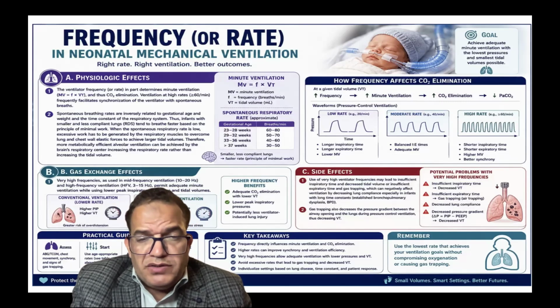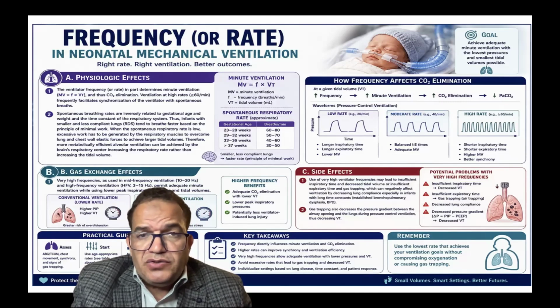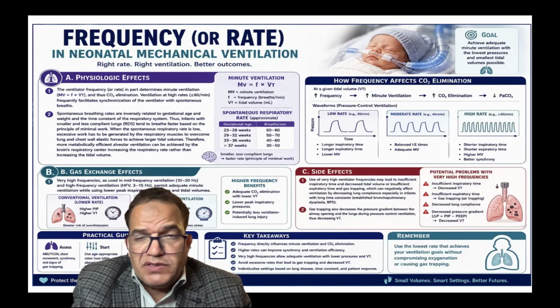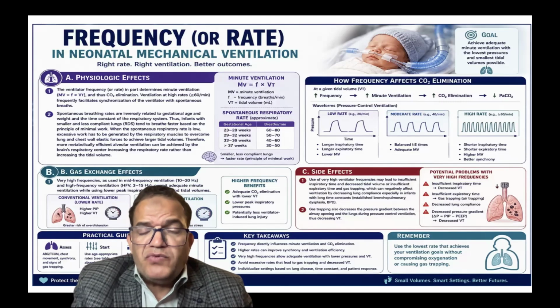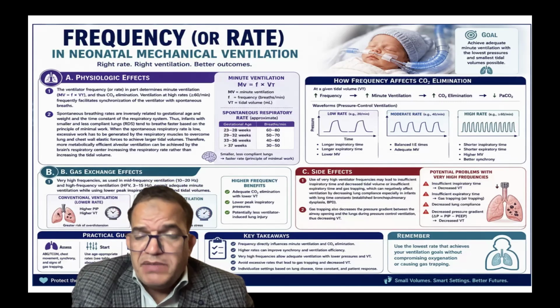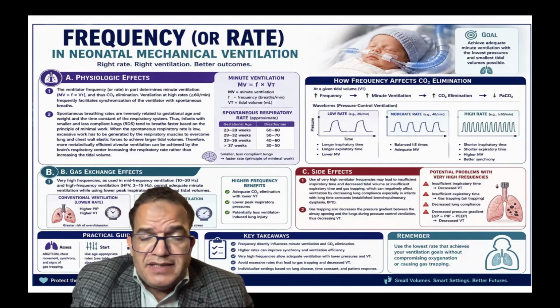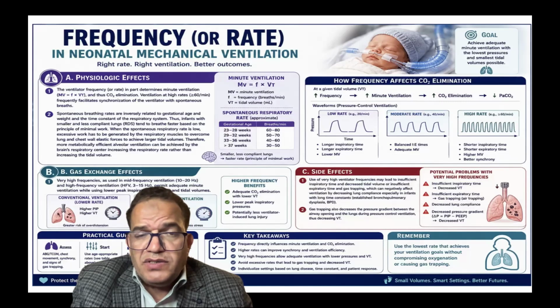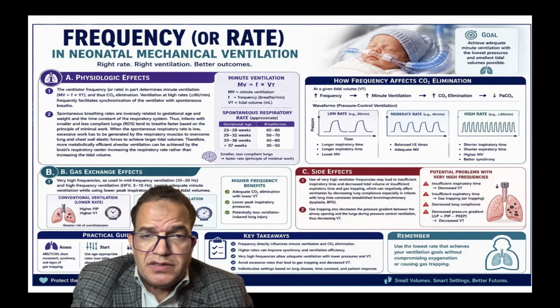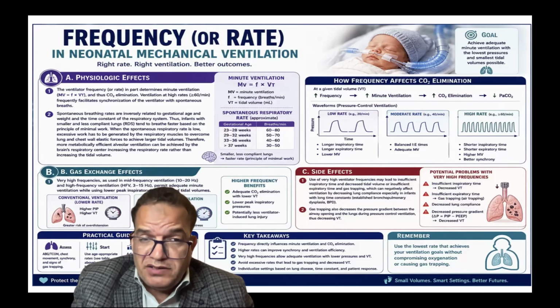They move towards very high frequency rates when they start to use high frequency ventilation, either jet or oscillation. Here they are ventilating the baby on very, very high rates and with very minimal tidal volume. And the aim for that is to avoid ventilator-induced lung injury, because we are avoiding giving a high tidal volume.